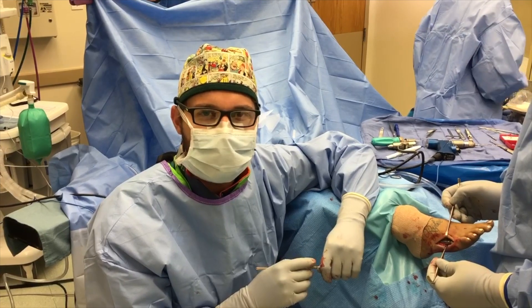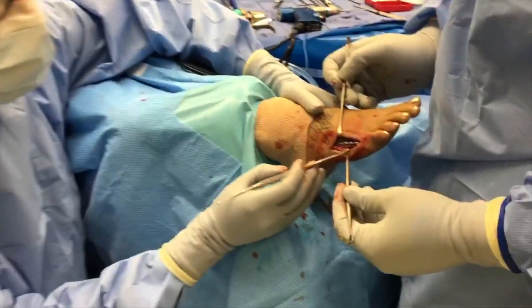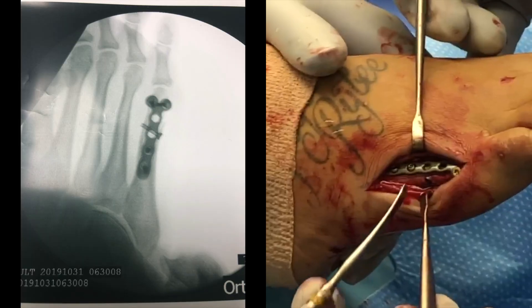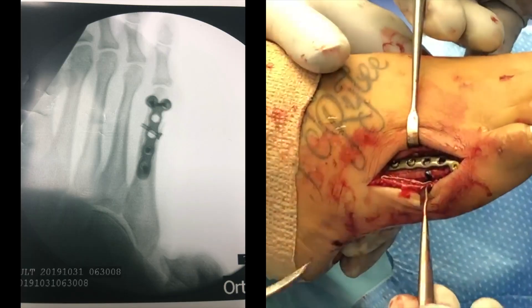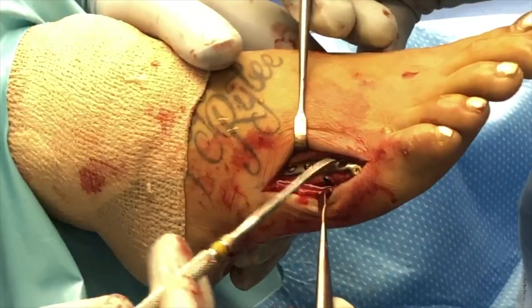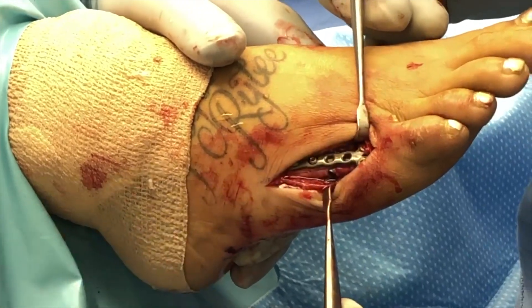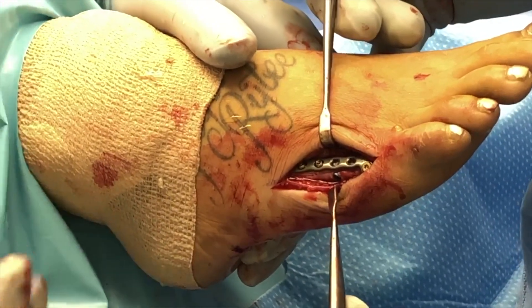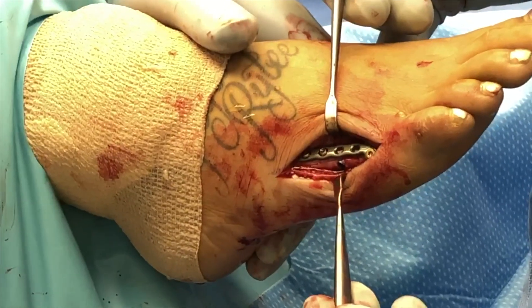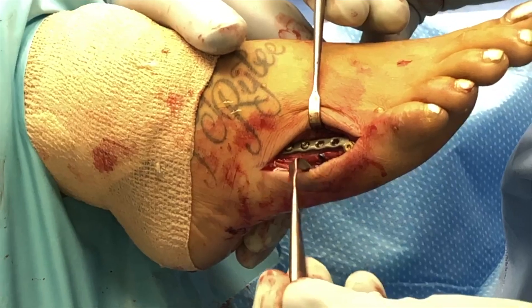Just at the end of the case here, I just want to show you the hardware we used. We have a little blue screw at the tip of my instrument here that comes across the fracture fragment to compress it together. And then because this patient needs to weight bear early, we use the plate over top of it — we have one, two, three, and there's a fourth screw hiding underneath soft tissue up there. This will allow the patient to weight bear approximately 10 to 12 days post-op. We'll close her up and she'll be good as new.